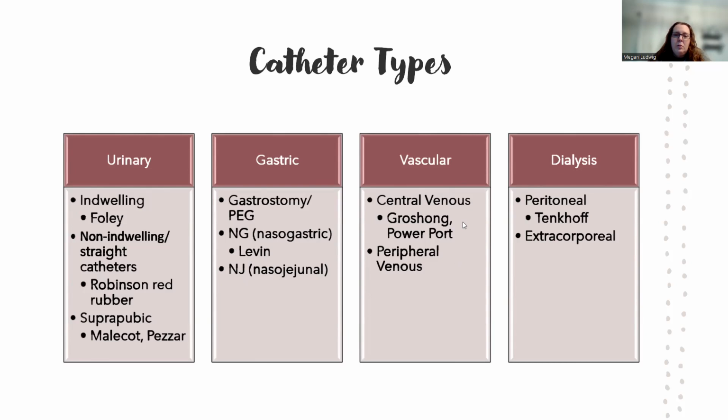They're to gain vascular access, or maybe this patient needs long-term cancer drugs. Instead of having to stick somebody a million times, you've already got that vascular access port right there. It's much easier.